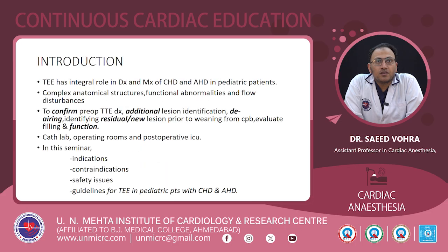To start with, TE has a very integral role in diagnosis and management of congenital heart disease and acquired heart disease in pediatric patients. It can help in complex anatomical structure understanding, functional abnormalities, and flow disturbances. TE is used to confirm the pre-op transthoracic echo diagnosis, to have additional information about the other lesions, for de-airing while coming off bypass, to identify the residual or new lesion prior to weaning the patient from CPB, and to evaluate the function and the filling of the ventricles.